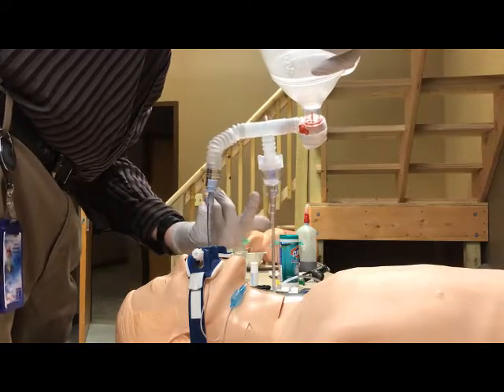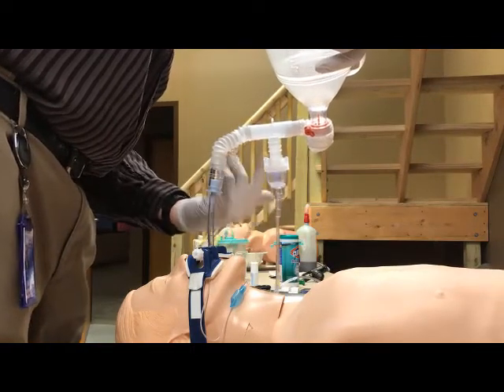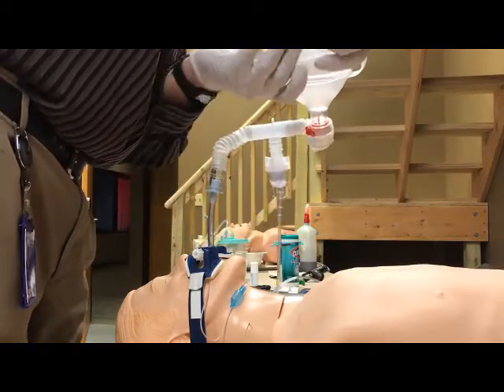Notice the nebulizer stays upright as well, so we're able to keep the medication at the bottom where it can be nebulized and flow in properly.